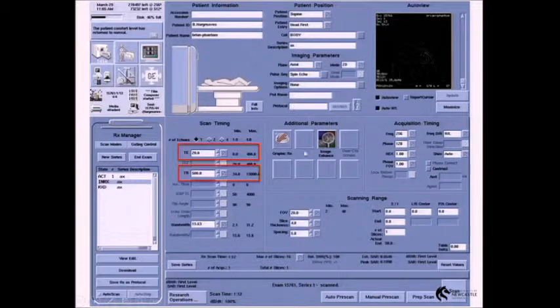See if we can see on here where it says this is a spin echo. This would be a simple spin echo experiment. You can see the other thing that we've selected is that we only want one echo. Sometimes you can collect two. You can collect a proton density and a T2 weighted at the same time. But that's typically the interface where the radiographer sits, and that's what they have control over. They're the parameters that they're changing to achieve either a T1 weighted or a T2 weighted scan.